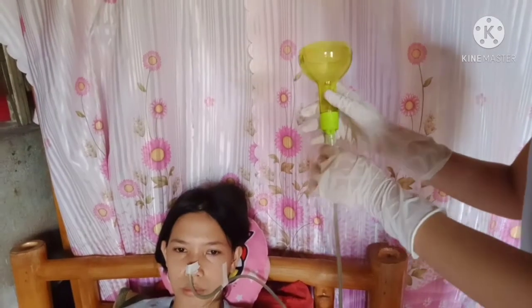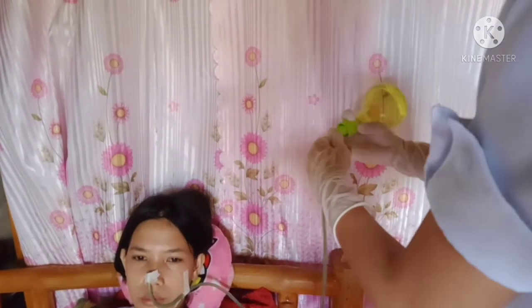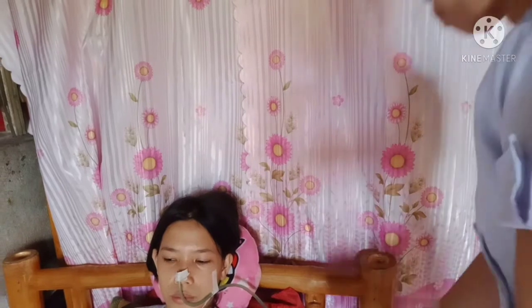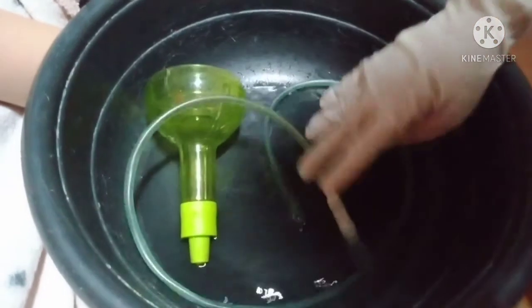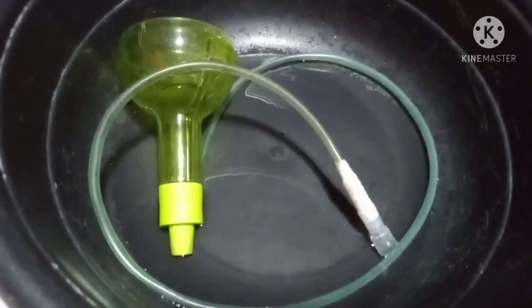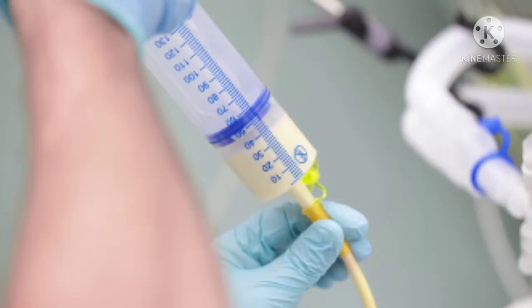So after that, we have to take off the bag or the tube feeding container and then put the cap on. And then we have to rinse the bag and tubing with warm water whenever feedings are interrupted. So rinsing the bag and tubing with warm water clears old tube feedings and reduces bacterial growth. And measure the amount of aspirate every 4 hours to evaluate tolerance of tube feeding.